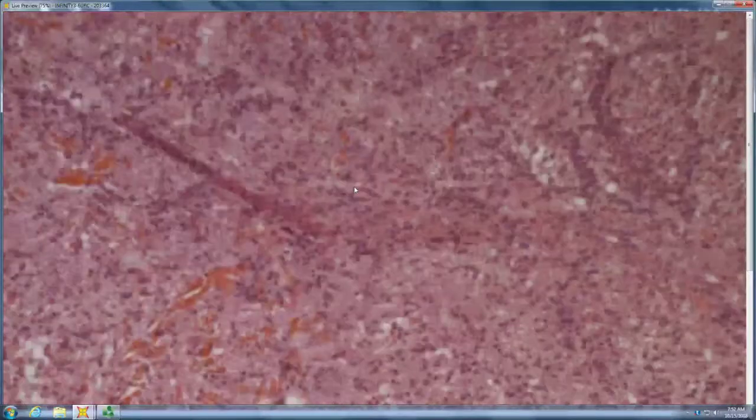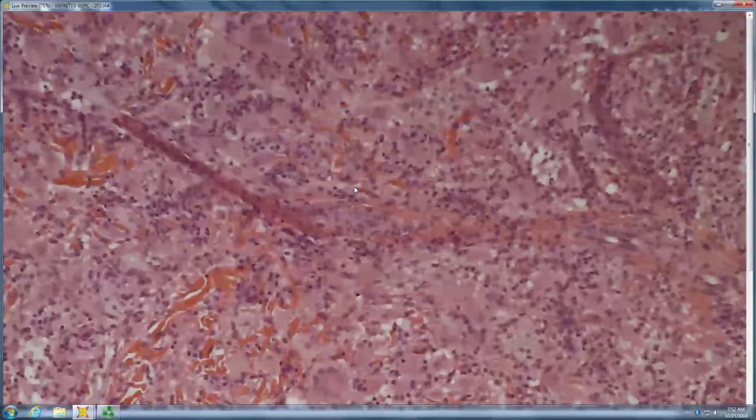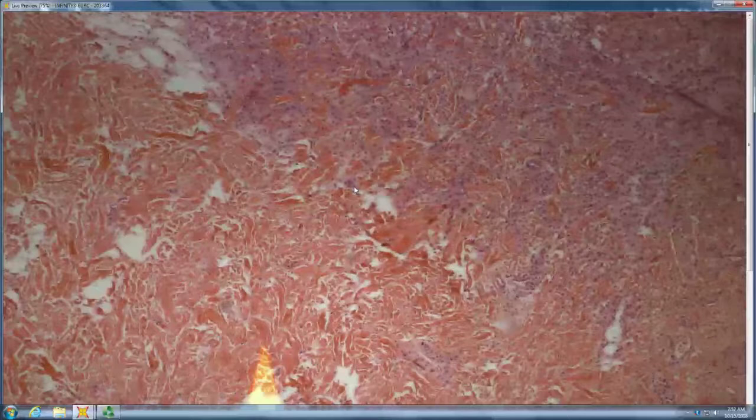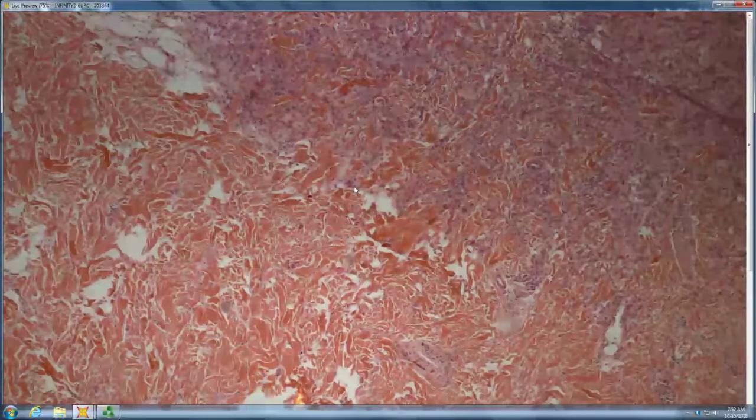Anyone want to jump in? JXG. What if you see giant cells? So they look like Touton giant cells, right? Wreath giant cells, lipidized peripheral to the wreath, and it tends to be the periphery of the lesion that has most of them. In this case, your collagen's pretty red, so your patient probably is juvenile, right?